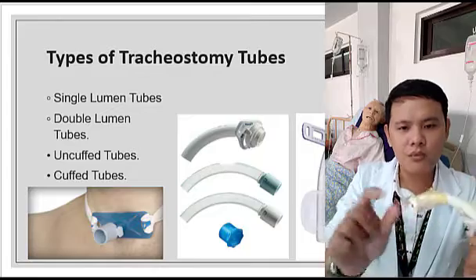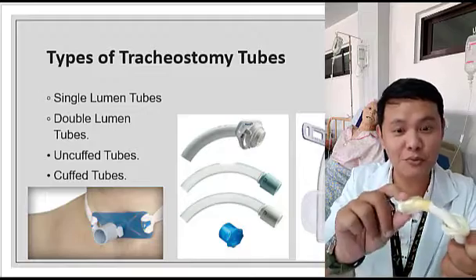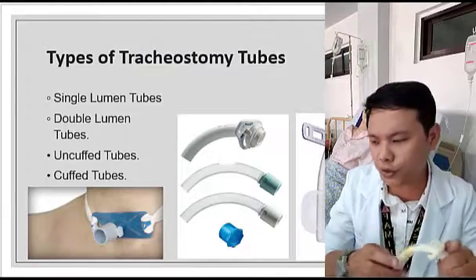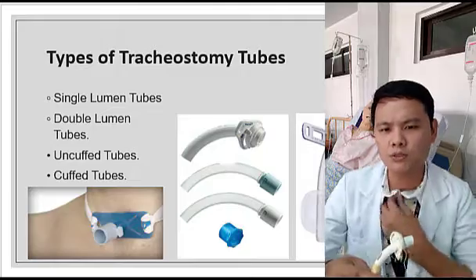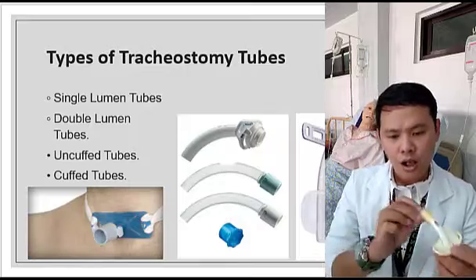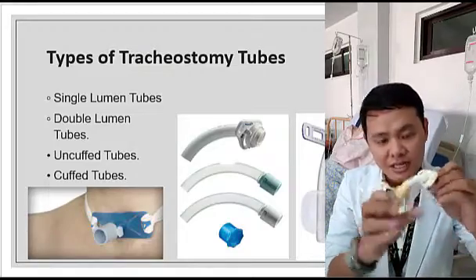So, what's the purpose of this? Okay? The cuff tubes. Para po itong sa may BP cuff. Okay? Lumolobo po siya. This one serves as a lock. Okay? At the same time, hindi magkakaroon ng obstruction, hindi magkakaroon ng trauma kapag nagagalaw yung tracheostomy. Okay? Hindi magkakaroon ng trauma inside the trachea. Okay? Kasi kung merong cuff na ganyan, it is really placed.